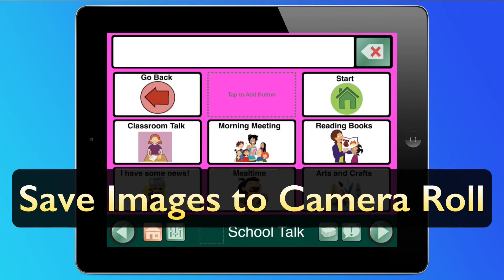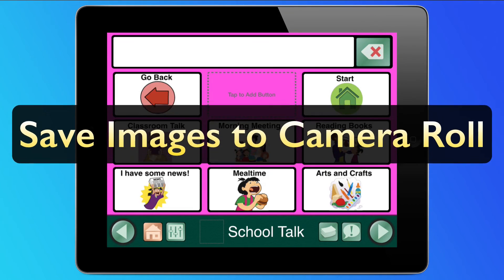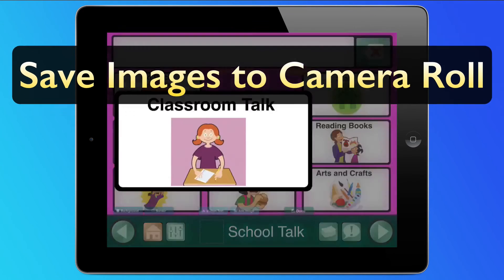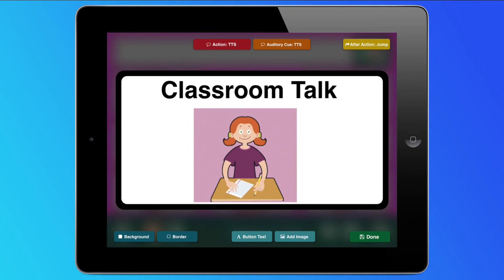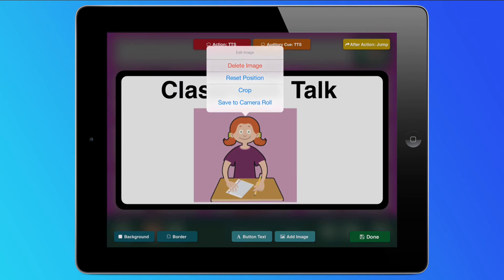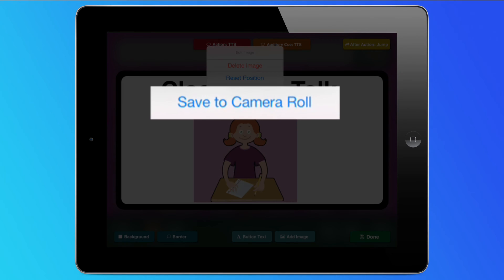Button images can be saved to the iPad's camera roll. While editing, simply hold your finger down on the image and then select Save to Camera Roll. It's as easy as that.